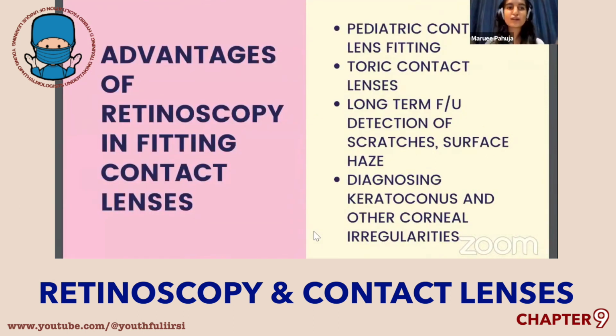Just summing it up, the advantages of retinoscopy in fitting contact lenses: in the pediatric population, it's a really, really good step. It is something that is essential. There is no way out but to do this. In fitting toric contact lenses, and like I mentioned, in assessing the fit of toric contact lenses, the degree of rotation that you see.